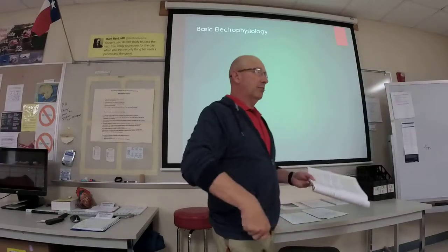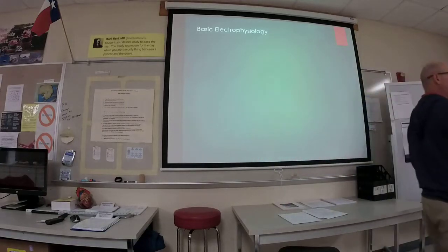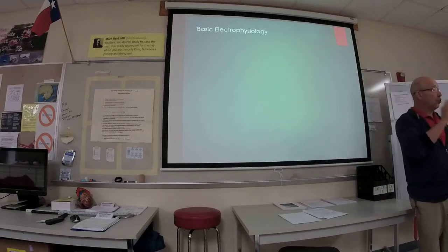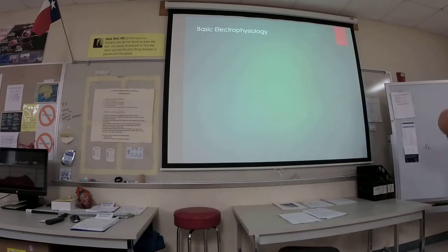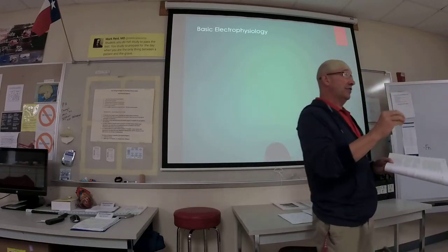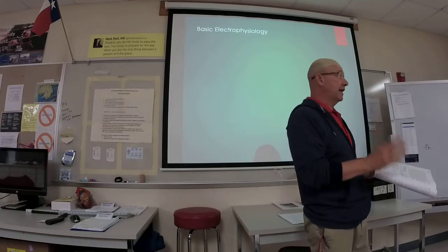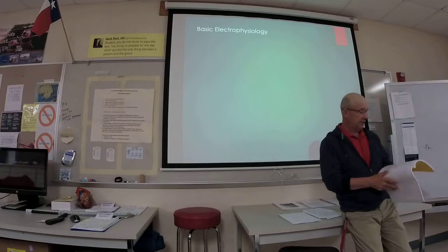The portable EKG machine itself has a 3-pronged electrical plug. That third prong, the round one, is a ground. It looks like a little doghouse looking thing. Anyway, that's a ground. You really want that on an EKG machine to ground it, because sometimes you get, we'll talk about in just a second, 60 hertz interference, and that ground prevents or helps prevent that artifact, that 60 hertz interference. Okay.